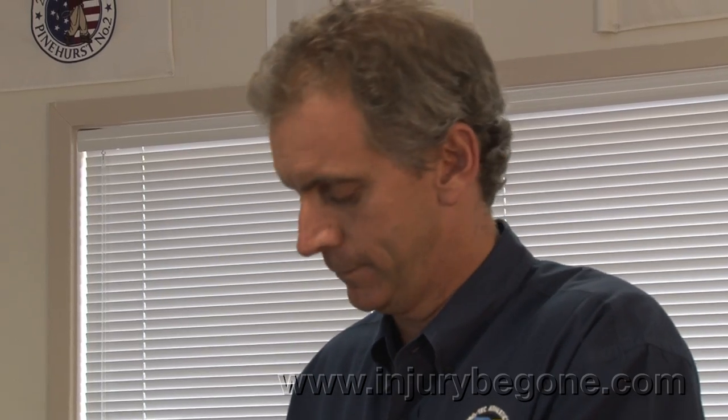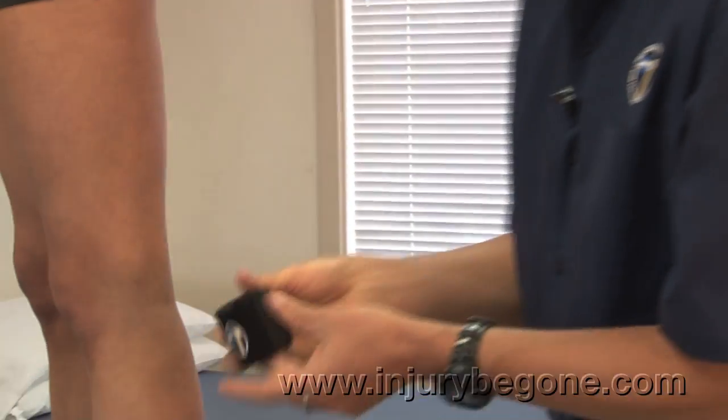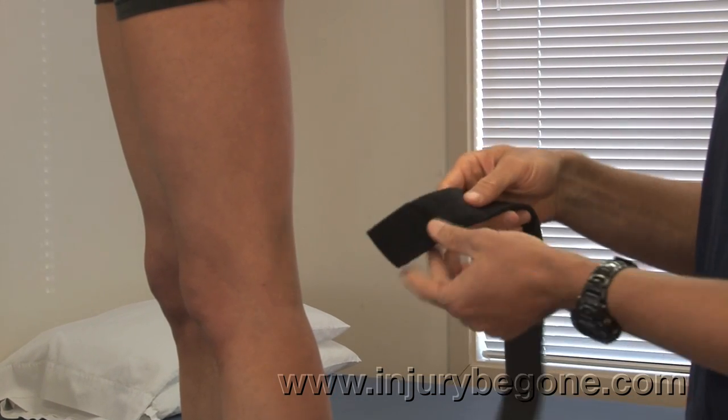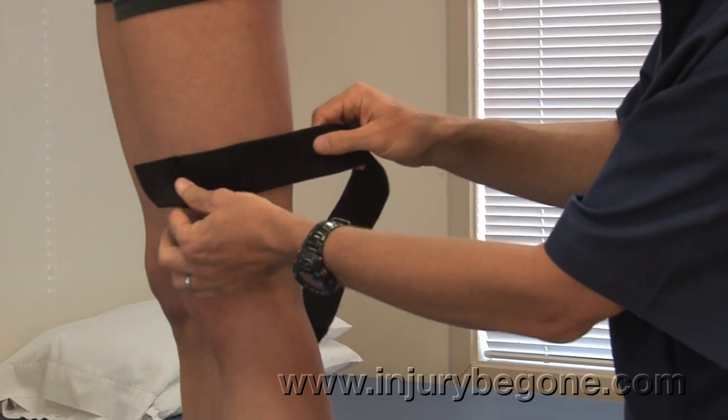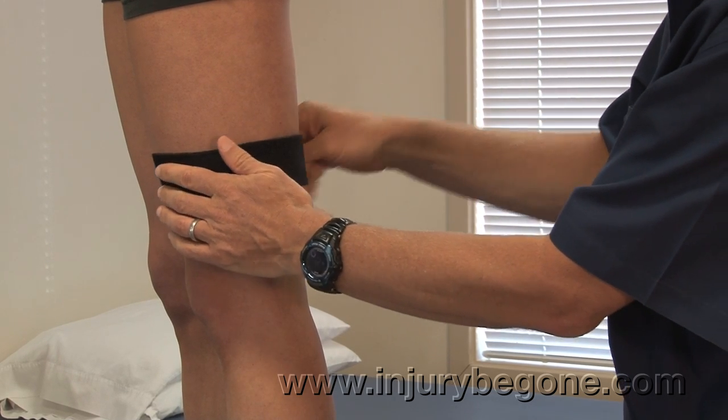The IT Band Compression Wrap offers effective relief for iliotibial band syndrome. We're going to place the compression pad right on the IT Band, approximately 2 to 3 inches above the patella on the outside or lateral aspect of the upper leg.